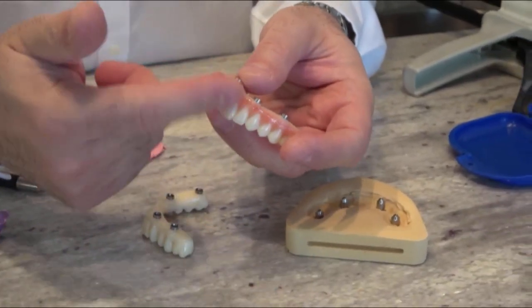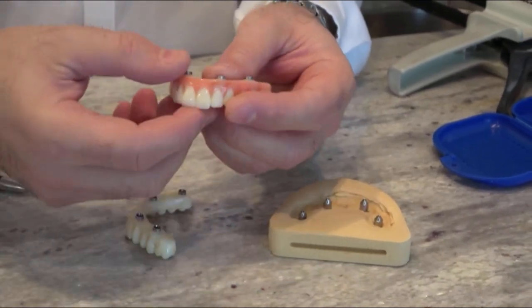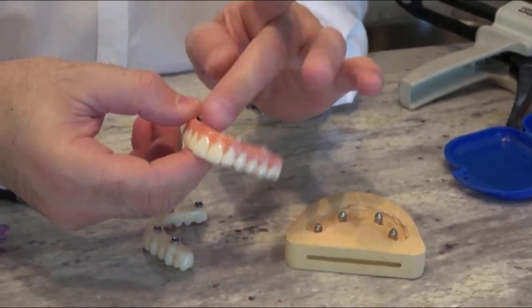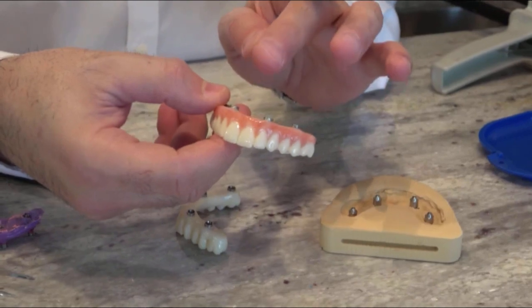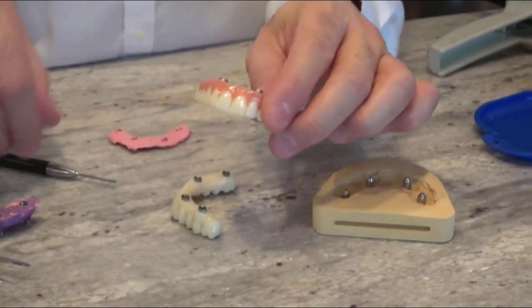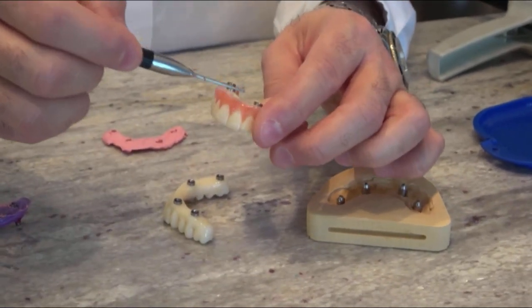You can add or take away anything you want on the soft tissue if there's pressure, or sometimes maybe test drive it for six months because the tissue is still shrinking. And now you have a gap between the soft tissue and the PMMA.